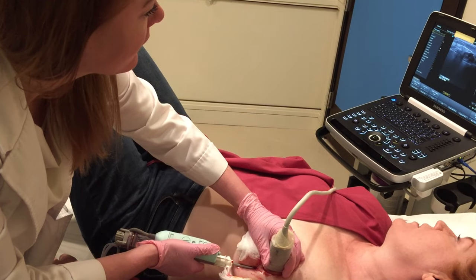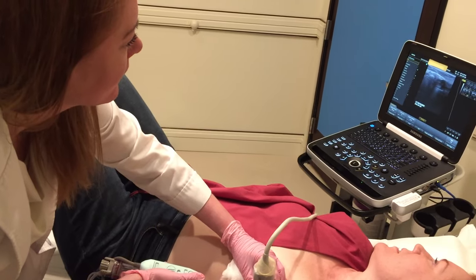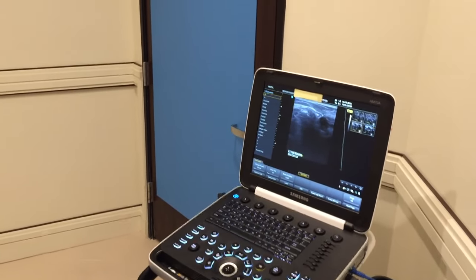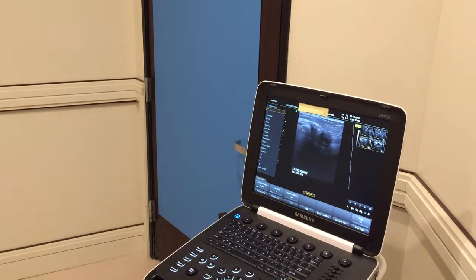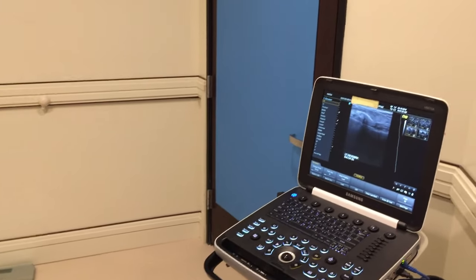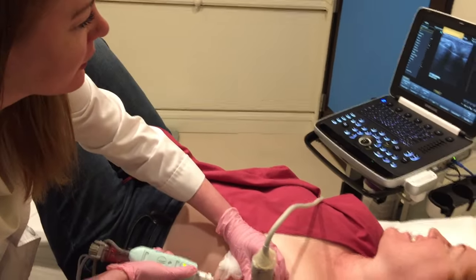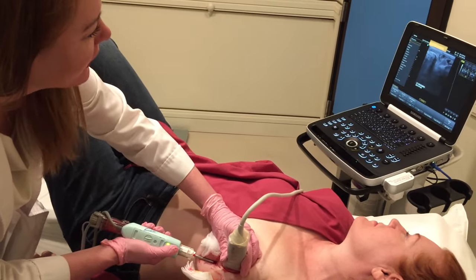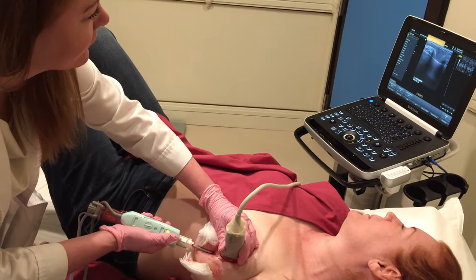Is it hurting anywhere? Are you okay? No, I just felt the pressure but it doesn't hurt, actually. Now watch — we're going to watch it go away. We're just going to press the button and watch it go away. That's one. There's two, and you can see it getting smaller and smaller. Is it hurting at all? I feel it but it doesn't hurt — just a little kind of funny pressure. Yeah, I feel it leaving. I'm going to do one more and you're out of here. Okay, we're done. That's great. Wow, that was fast.